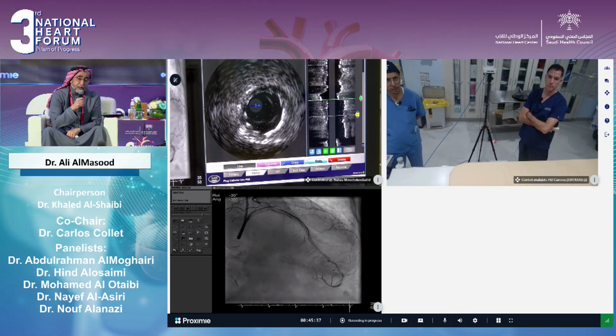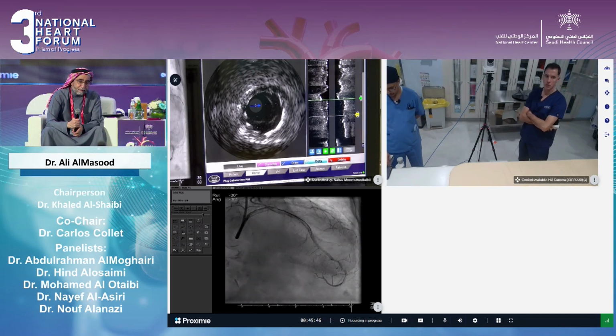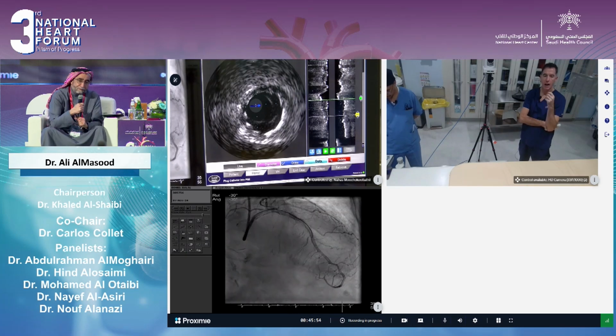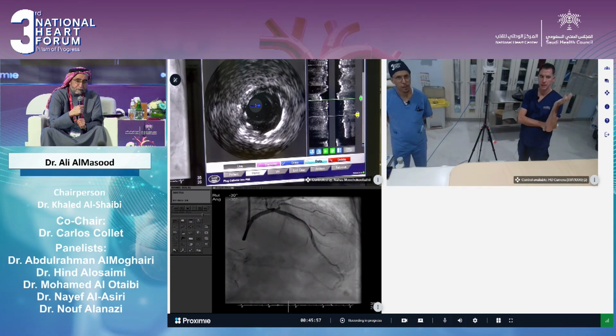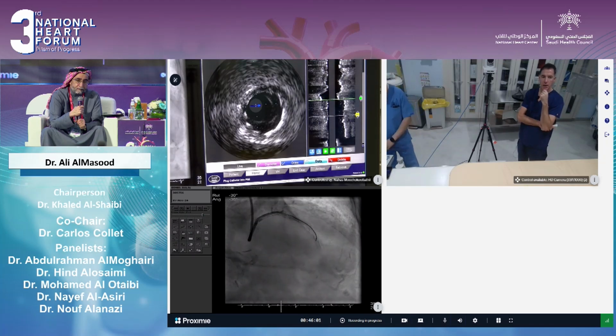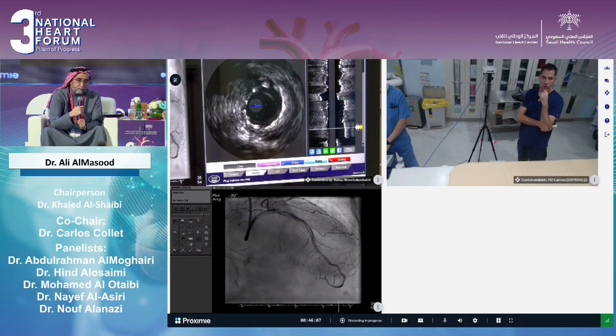Did you take a spider shot by any chance? No, once I've flown all branches to see IVUS, it tells me whether I'm finished or not. So I don't do other angiographic views because I don't really think it helps. This was the best view, showing the ramus branch, and it was free of disease. The lesion was beyond the ramus, so we were very pleased that we didn't have to go into that. It's very retroflex to try and treat that.